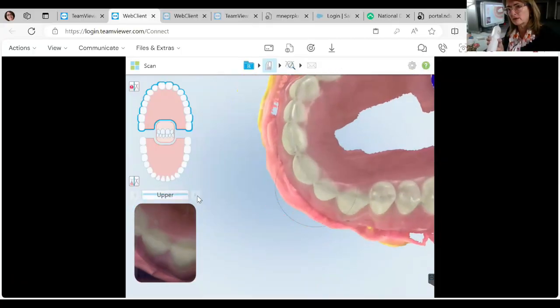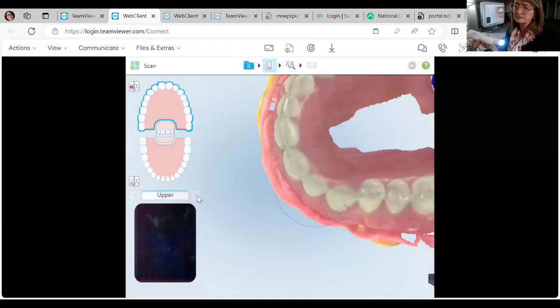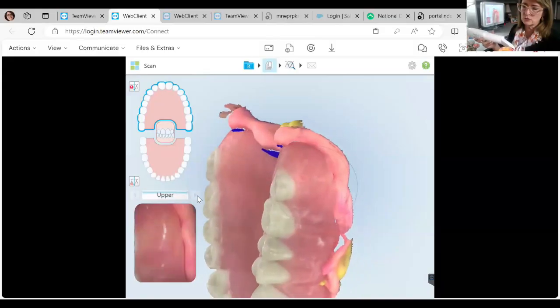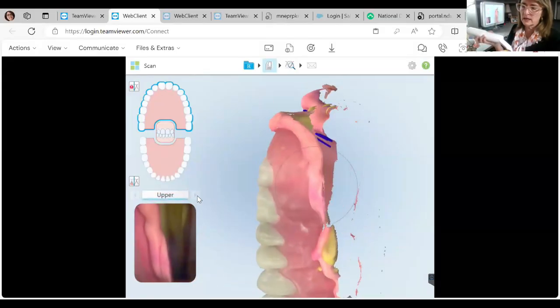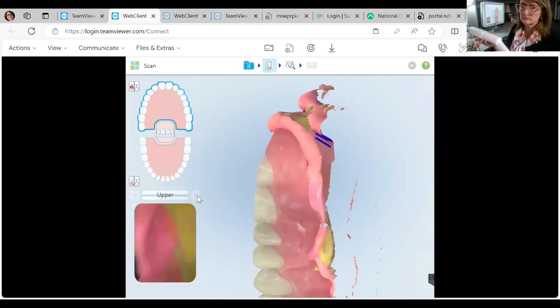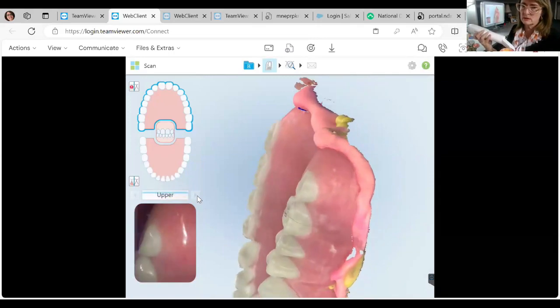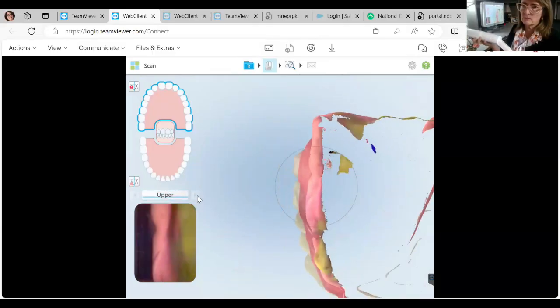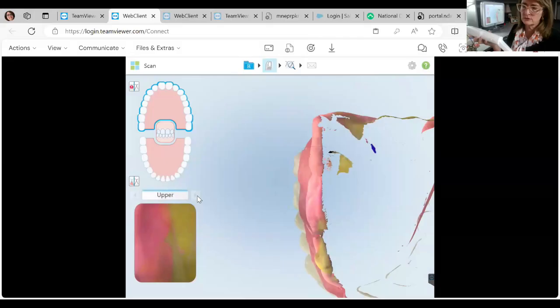Make sure those anterior teeth all connect together. And then I'm coming over right around like tooth number 2. And I'm going to roll over. This is the most challenging part. So I'm going to stay in contact with that border. I'm going to roll over to the intaglio.